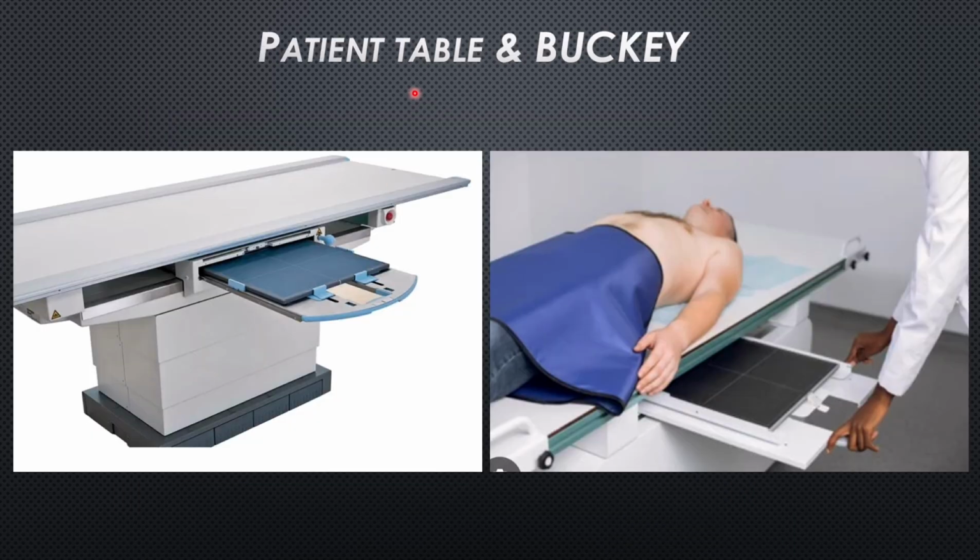Then we have the patient table and bucky. This is the patient table on which the patient is lying, and just below it we have the detector and bucky.